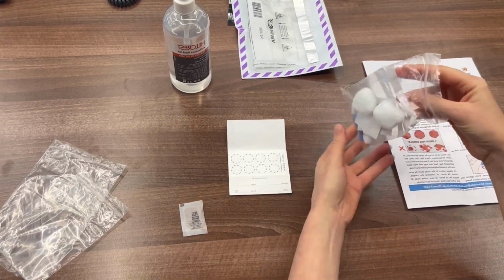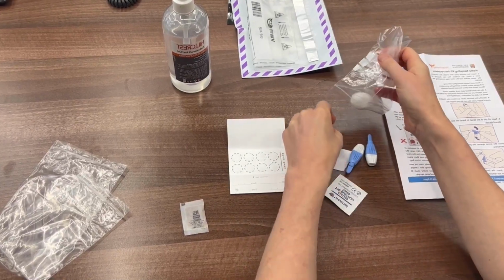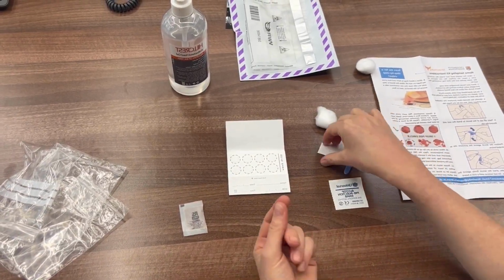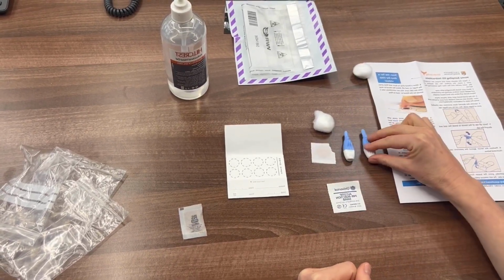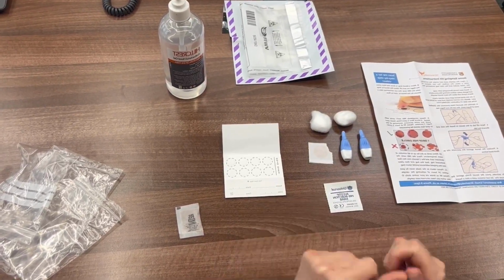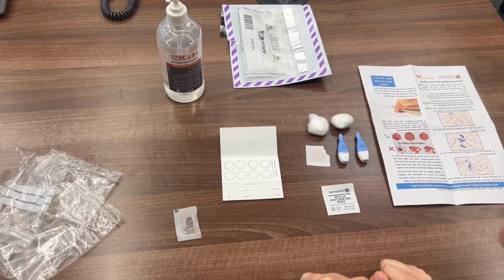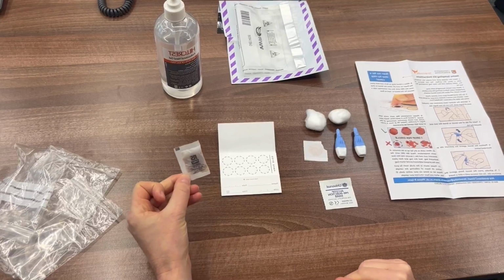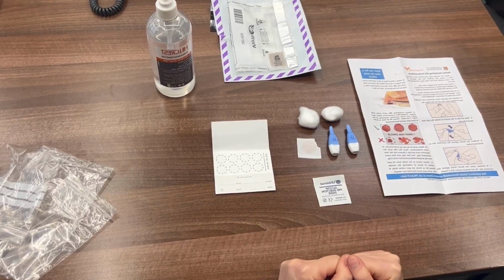Inside the other little bag, we have an alcohol swab for cleaning a finger. We have a lancet and also a spare lancet. And then we have some cotton wool to use after we've done the finger prick. And then we've got a plaster for afterwards if you need that. There is also a little desiccant gel pack, and that will go with the return sample to make sure it stays safe and dry.